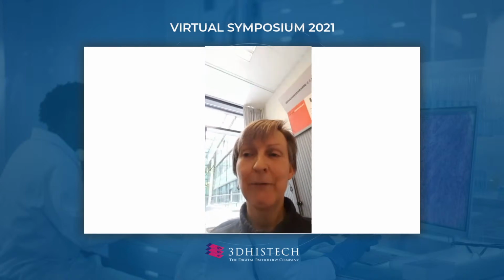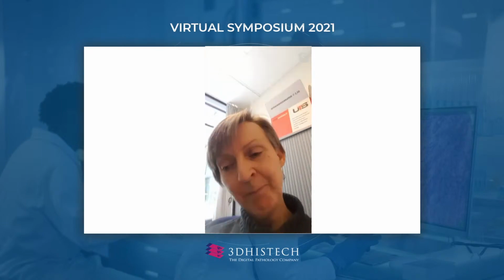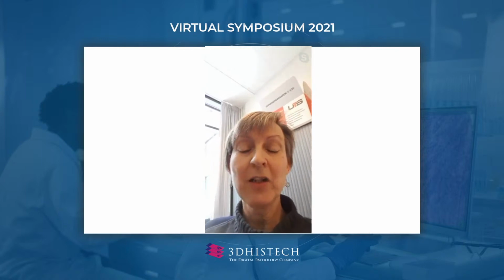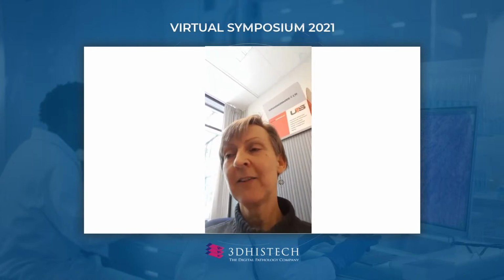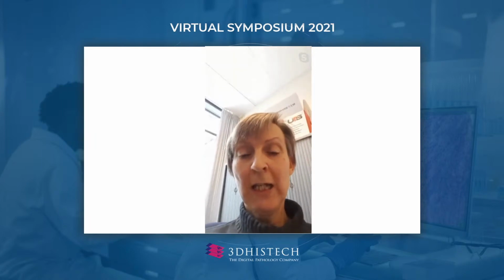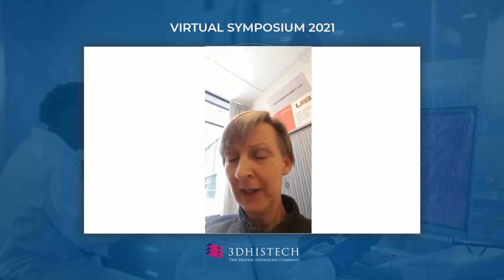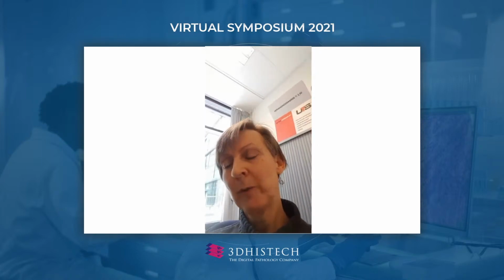But now we have a system where we can send a chat in the Sectra image management system very easily to the technician who is doing the quality check. And so they just ask us, please let me know if you want a rescan, and they do it immediately. So it works very well. I think the number of rescans is much lower now than in the beginning, because we have more experience and you can really work with a lot of the slides, even if a little part is out of focus. That's really no problem.